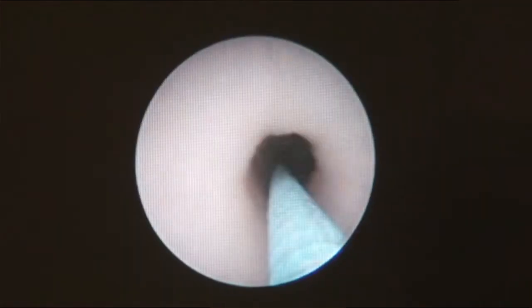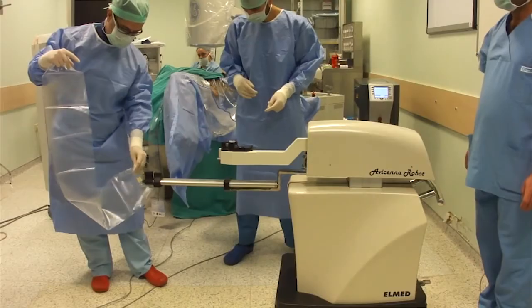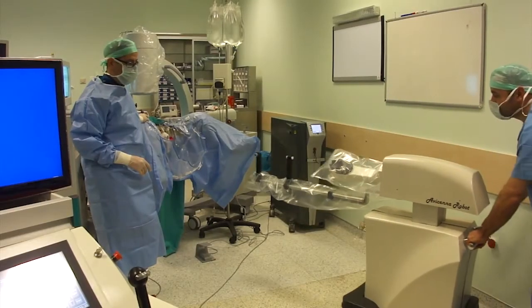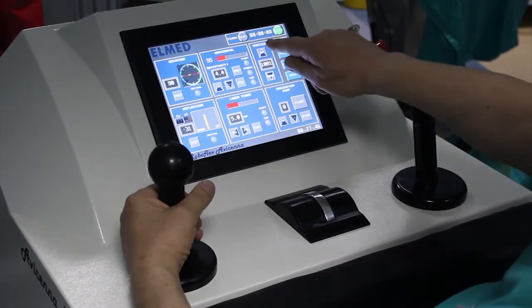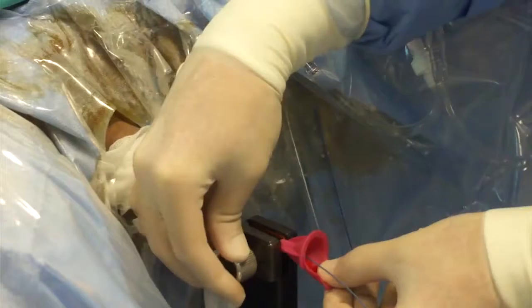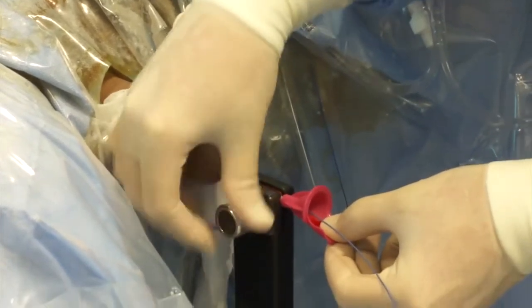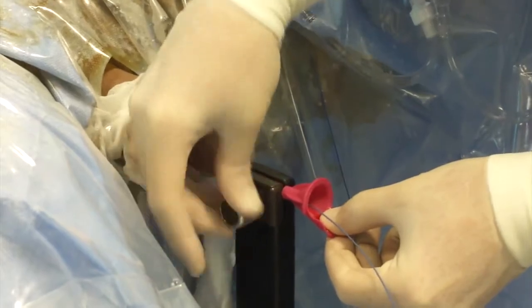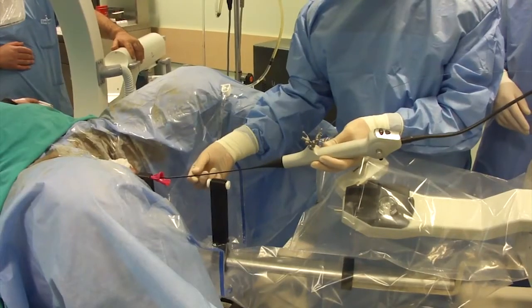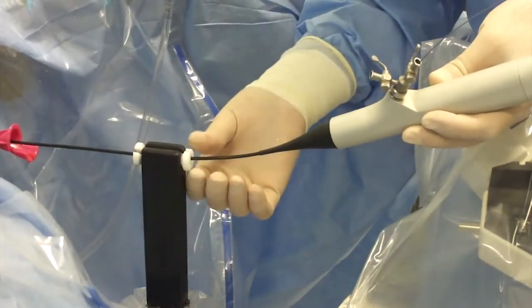After introducing the access sheath in the usual method, the robot with its sterilized draped arm is brought into the operative field. The height of the arm can be adjusted according to the patient's anatomy using the touch screen at the console. The access sheath is fixed by the distal stabilizer. The flexible ureteroscope is introduced into the sheath manually, supported by the proximal stabilizer.